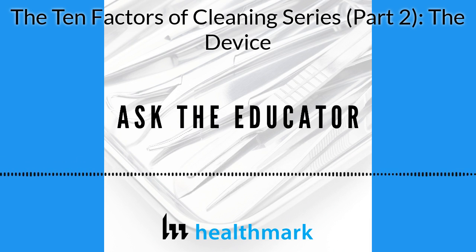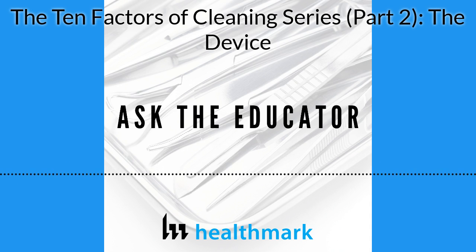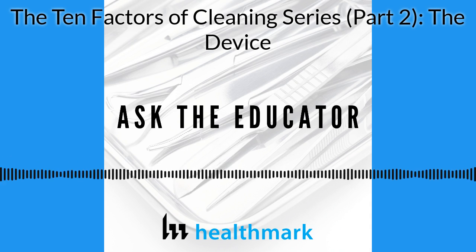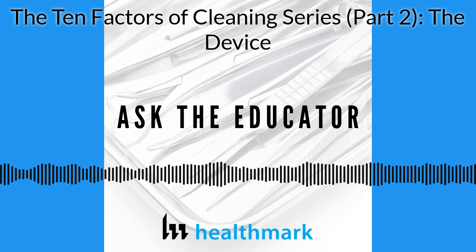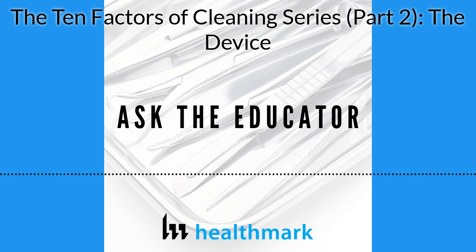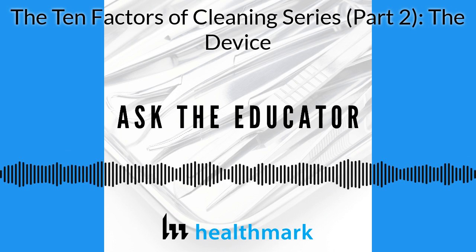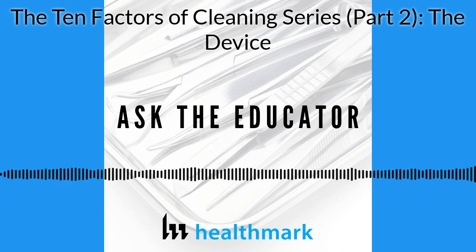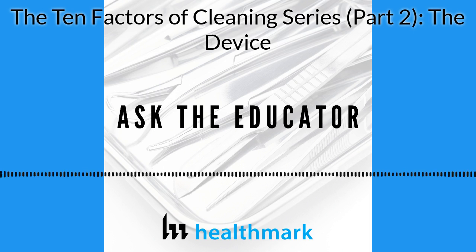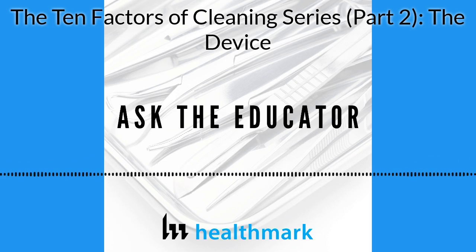There's another simple thing I'm going to word differently. A lot of people, fiber optic cords have to be hand washed. When they come through the pass-through window, sometimes you'll see people take alcohol or HLD and wipe the cord down, and it's silicone. Well, a lot of optical cords, when you read the IFU and train your staff, say you're not supposed to wipe it down or use certain chemicals, because it can be absorbed in that cord and then, through the sterilization process or something else, cause problems. So they have to know the design of it and the material. And it's just very important.